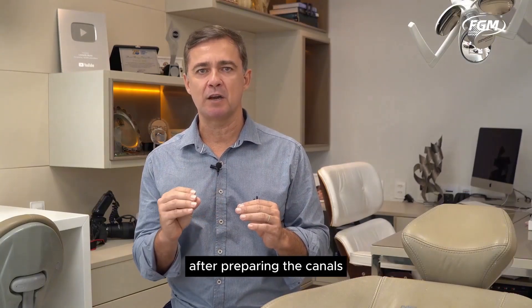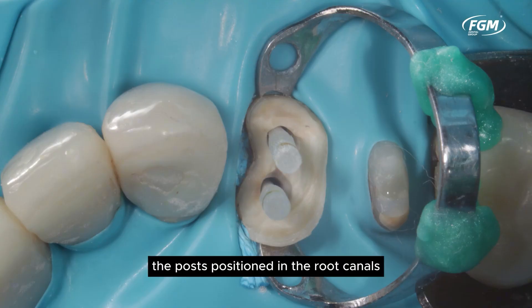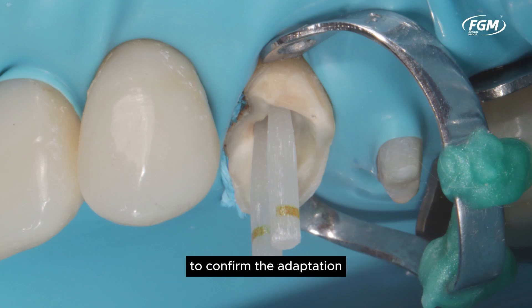After preparing the canals, we can note the white DC fit posts already adjusted for cementation. Observe in these views the posts positioned in the root canals. Next, we performed a periapical radiograph to confirm the adaptation.